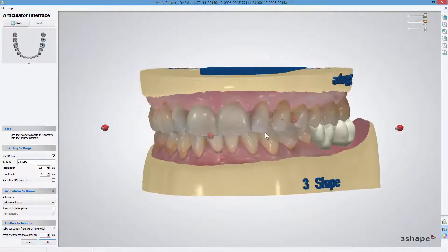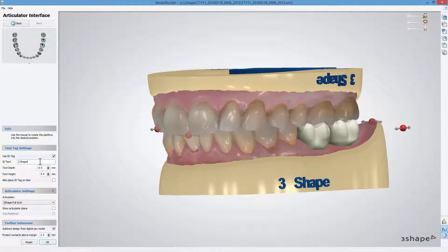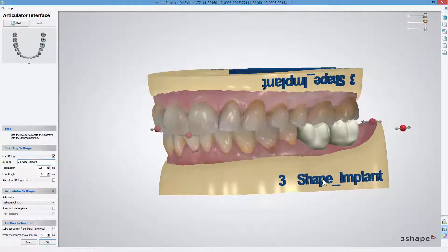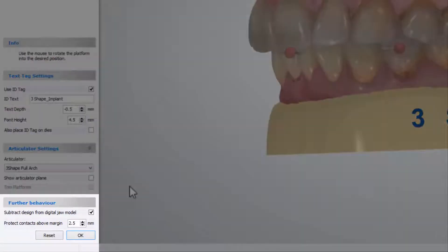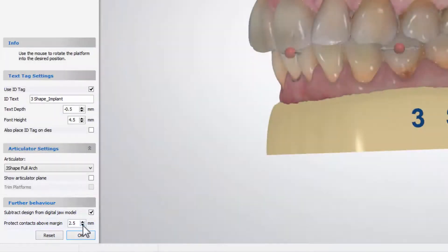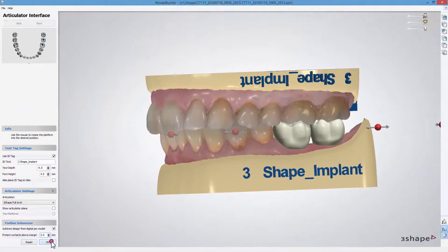At this point, choose whether to use the ID tags on the models, and set the text depth and font height for them. You also have two more options in the Further Behaviour settings. The Subtract Design from Digital Jaw Model checkbox, which is selected by default, cuts an area around the design — the abutment in our case — to make sure it can be extracted from the preparation. Protect Contacts Above Margin is very helpful if you don't want to subtract a design higher than the indicated value above the margin line, for example when you want to protect neighbouring teeth surfaces. Click OK when finished.